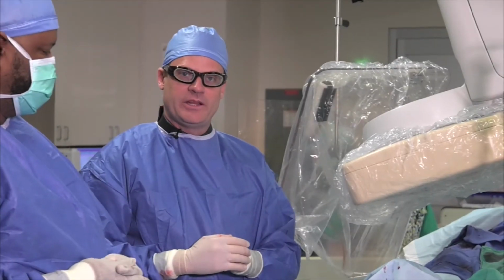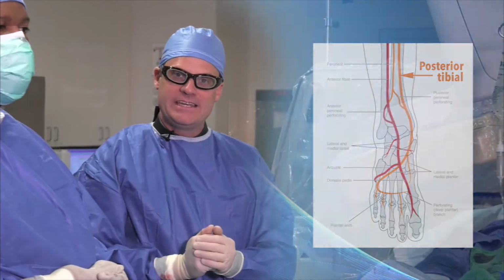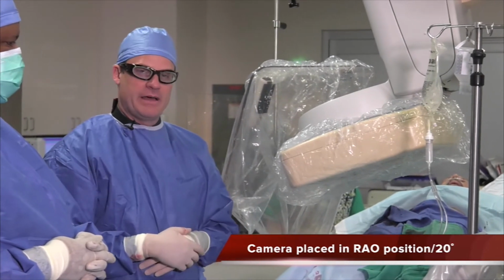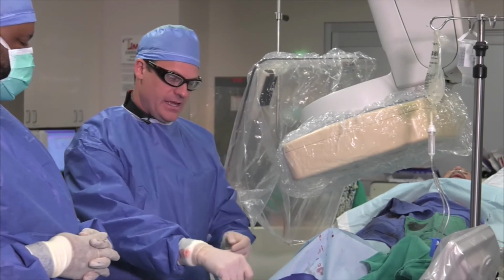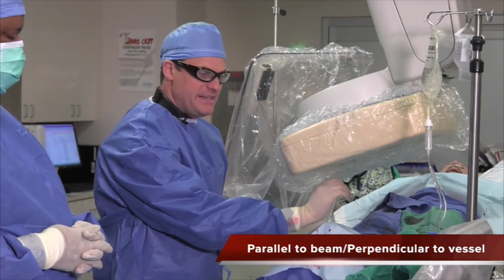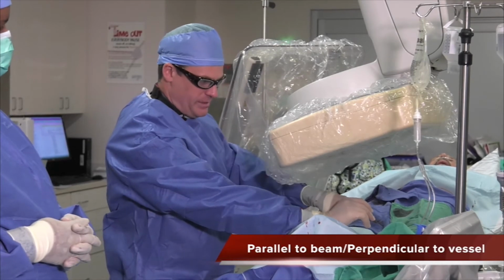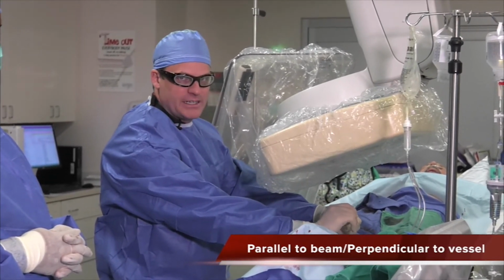So for posterior tibial access, to access it angiographically, remember the posterior tibial artery is medial. So we want to bring the camera, since we're working on his left leg, we want to bring it in an RAO. This is set up at about 20 degrees RAO. Remember, when we take the needle, it is going to be parallel to the beam and perpendicular to the vessel. Parallel to the beam, perpendicular to the vessel. So the beams are coming down, needle's parallel, vessel's running this direction, perpendicular to the vessel.